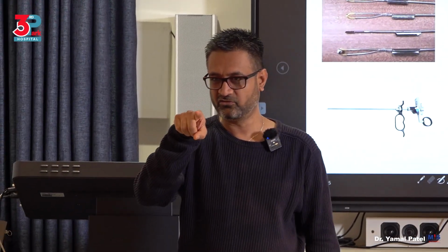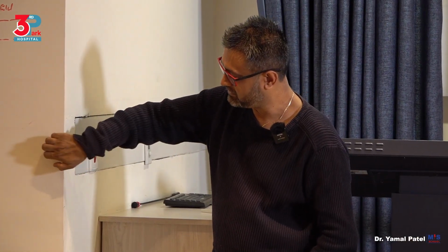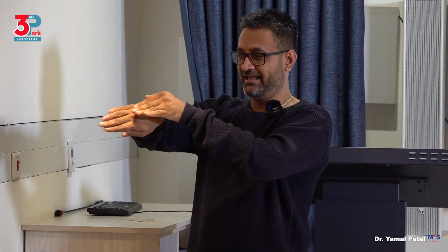It's rigid, it's straight. So if you're seeing very far off, when you're trying to, let's say, resect this part, you will need to be close to the view. Now, if I put it at 0 degrees, then I'm looking at it straight on. I won't be able to see the pathology and the tip of the instrument. So what I want to do is come up a little and see it from 12 degrees. You've understood? As I'm cutting.